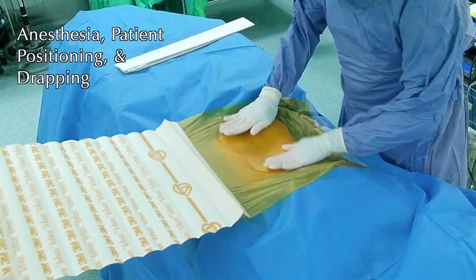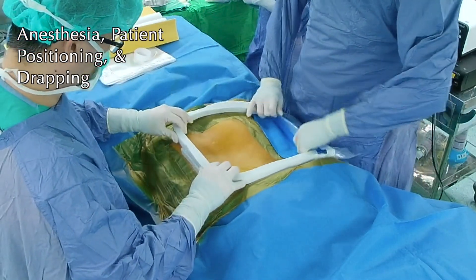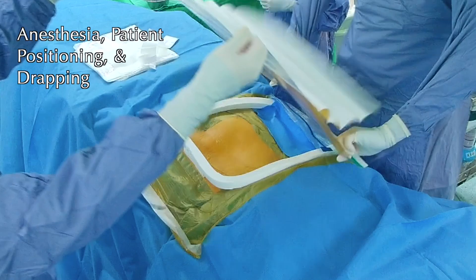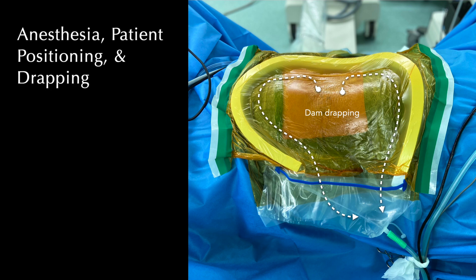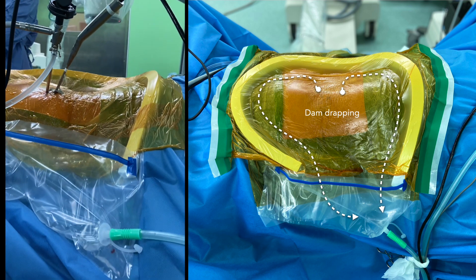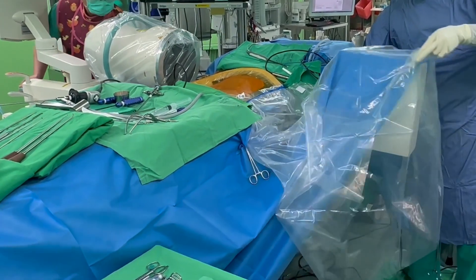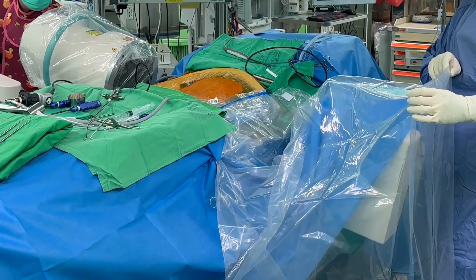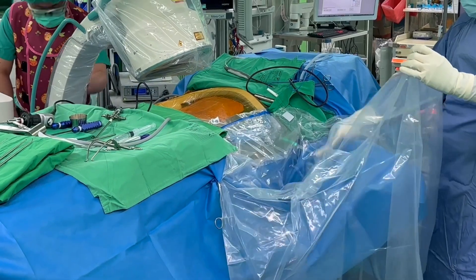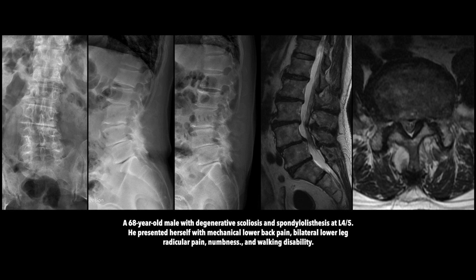BETLIF is performed under endotracheal general anesthesia with the patient placed in the prone position on a radiolucent spine table. Because the surgery is performed with continuous saline irrigation, watertight draping is essential to prevent hypothermia. The table should be adjusted to ensure the fluoroscope's free passage to obtain clear anterior-posterior and lateral images. A transparent covering hood for the fluoroscope is handy when checking the lateral image. The following procedures will be demonstrated at the L4-5 level from the right side approach.